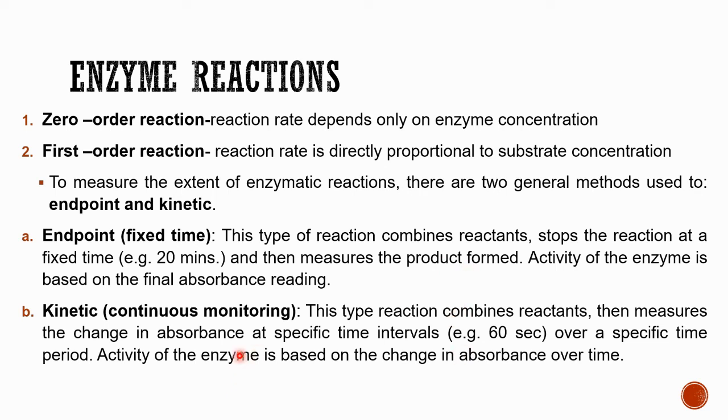Okay? For kinetic naman or continuous monitoring, so this type of reaction combines reactants, then measures the change in absorbance at specific time intervals over a specific time period. So activity of the enzyme is based on the change in absorbance over time. So for kinetic naman, hindi lang once nire-read yung inyong absorbance. Or pag sinabing absorbance, di ba, i-translate to parang mismong result mo. Okay, doon mo nakukuha yung result.